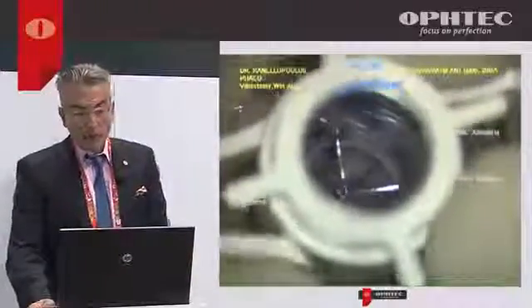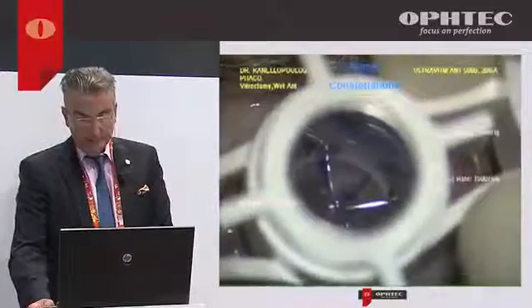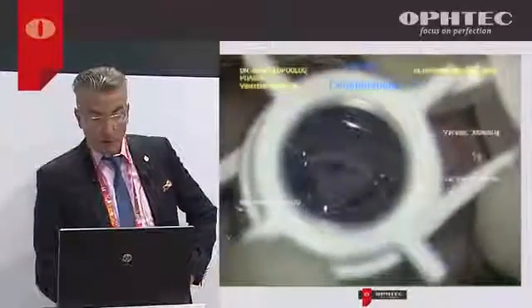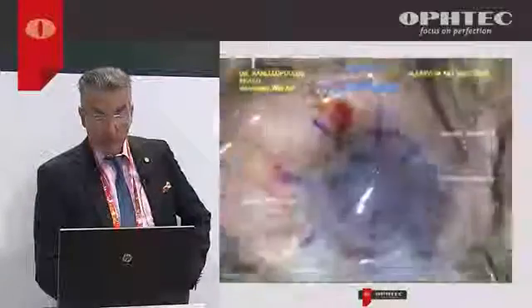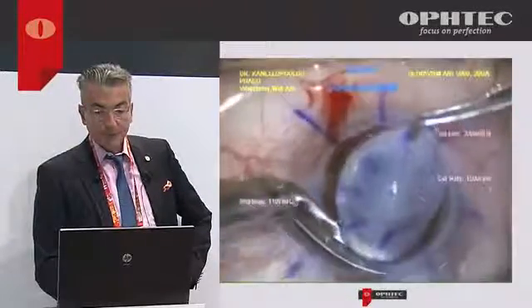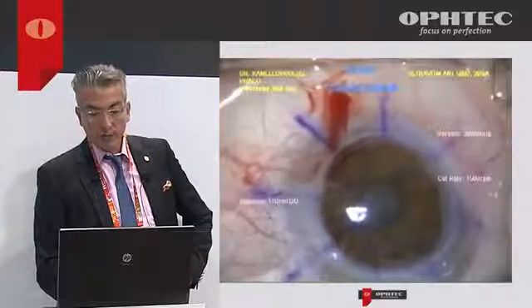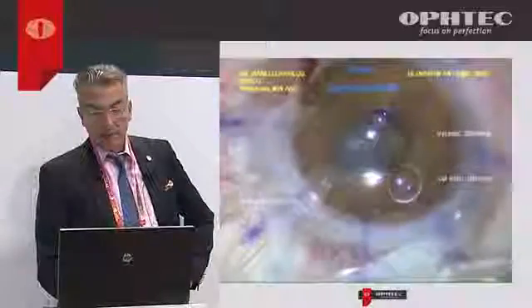So here the cornea is decompensated. We're going to perform a host cornea trephination. I'm going to fast forward this part and just leave you with the IOL implantation. So a trephination, the donor trephination, going in, removing the cornea, and you can see there's a dense cataract.